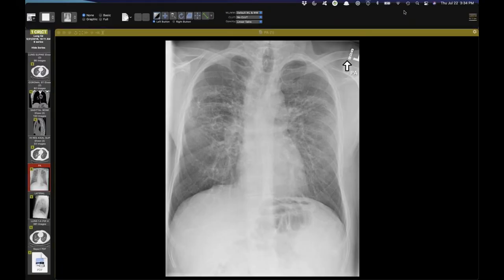All right, yeah, I'm just going to show one because I know there are lots of other presenters here. And this is one that I need people's help on. This is actually for our ILD conference this week. He's 67, this radiograph was done 3 years ago or thereabouts. And he's reported a history of dyspnea for going on 10 years now.